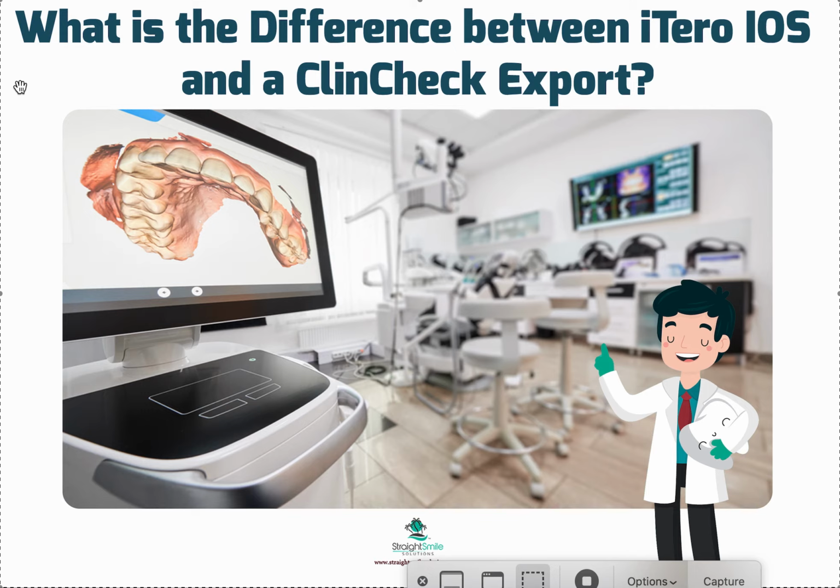So again, I want to emphasize, you should always ask your doctor to export the ClinCheck to you. It is something that will happen through email. You can't just click on it. You're going to have to put in some personal information, and your doctor will also have to give you your case number in order to do it. But you should always view it and accept it. It is not required, so it's something you'll most likely have to ask for. It's not going to just happen unless you ask for it, because if a doctor doesn't have to take that extra step, they would rather you just get going, and they may think that you don't care. So if you care, ask.